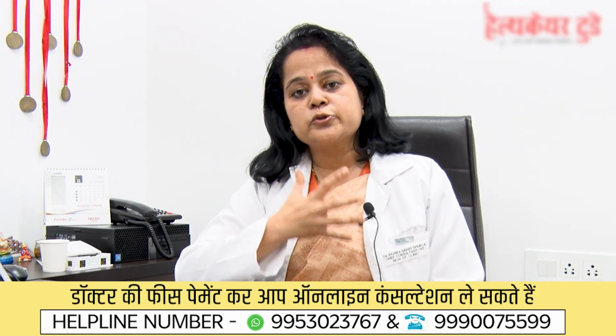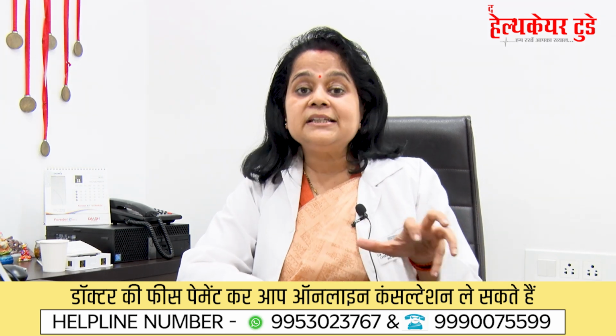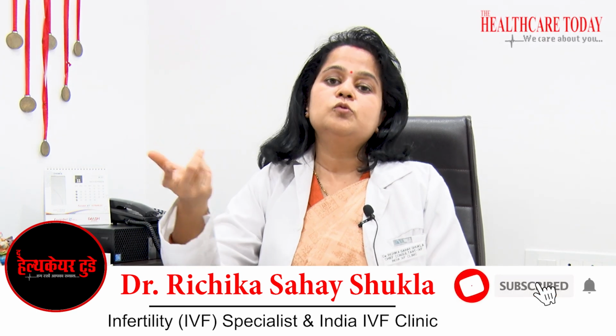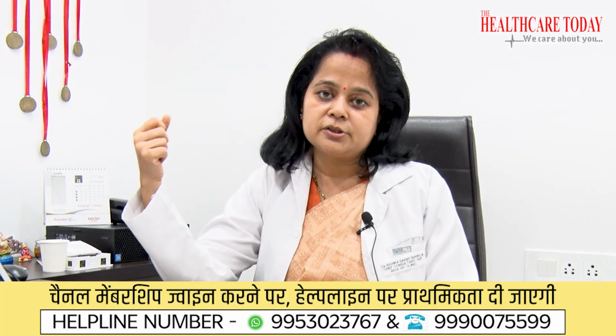So basically the hysteroscopy procedure doesn't target only one thing, but it targets many things together, and in the crux it gives us an insight into what to do for the patient who is having these recurrent failures or pathological problems in the uterus.